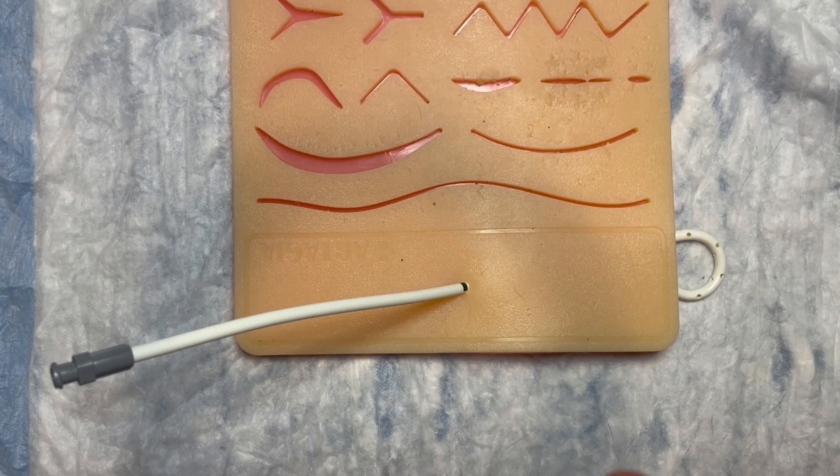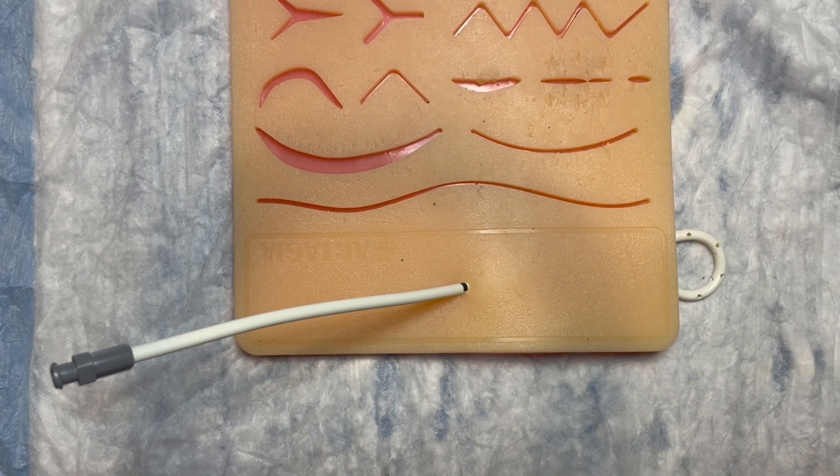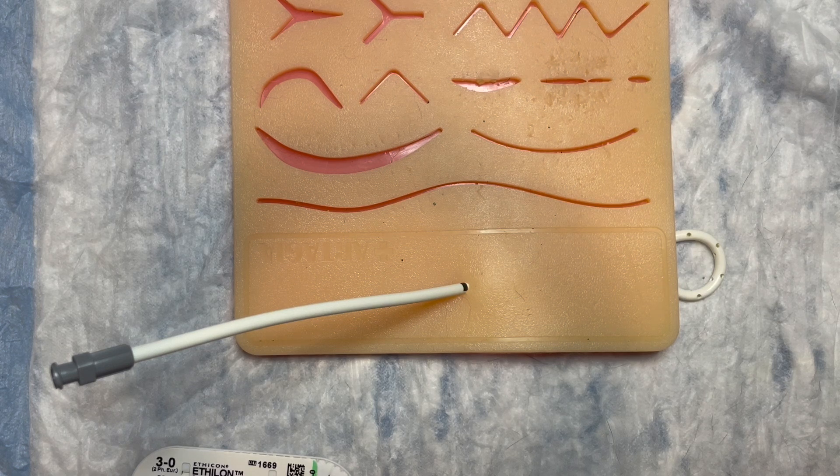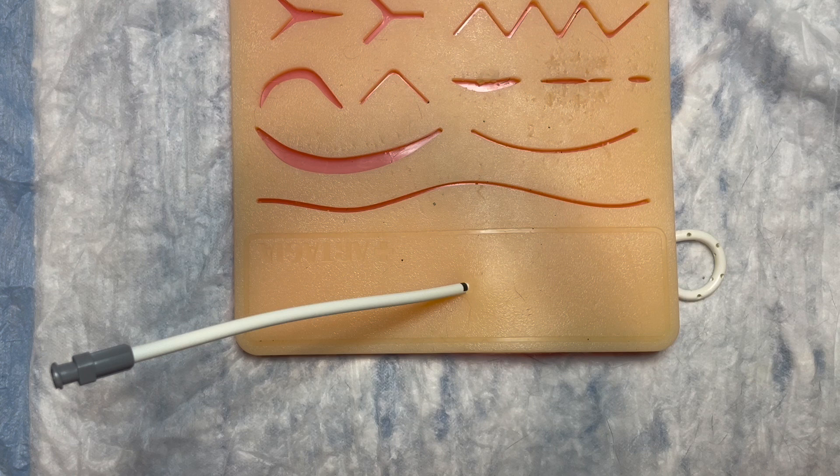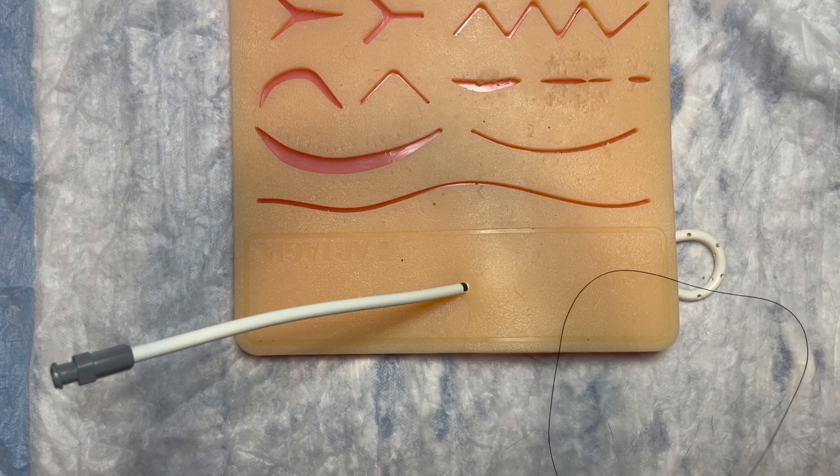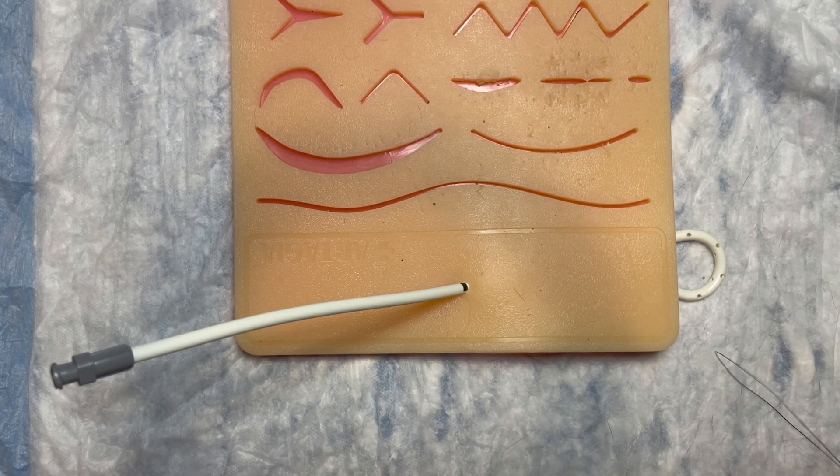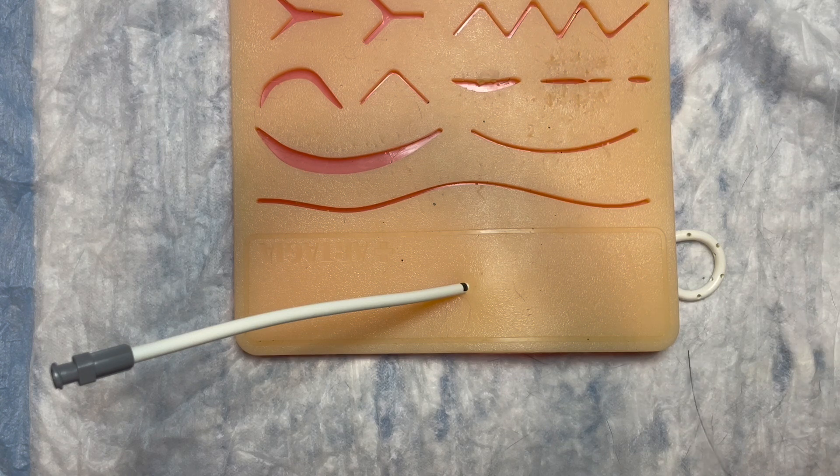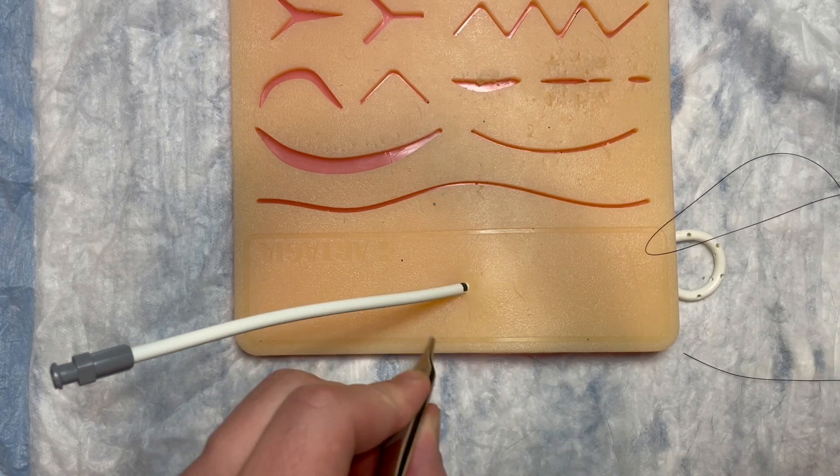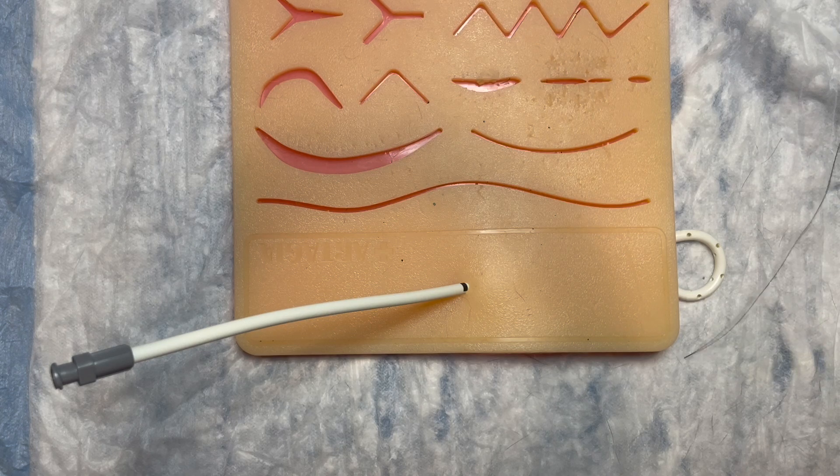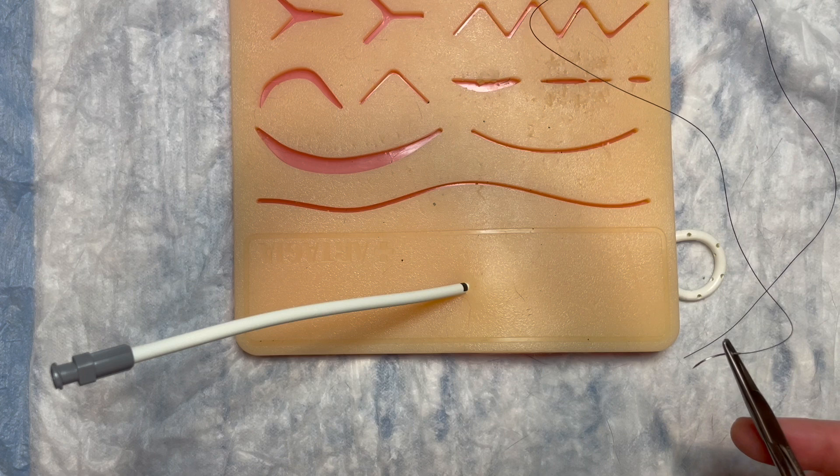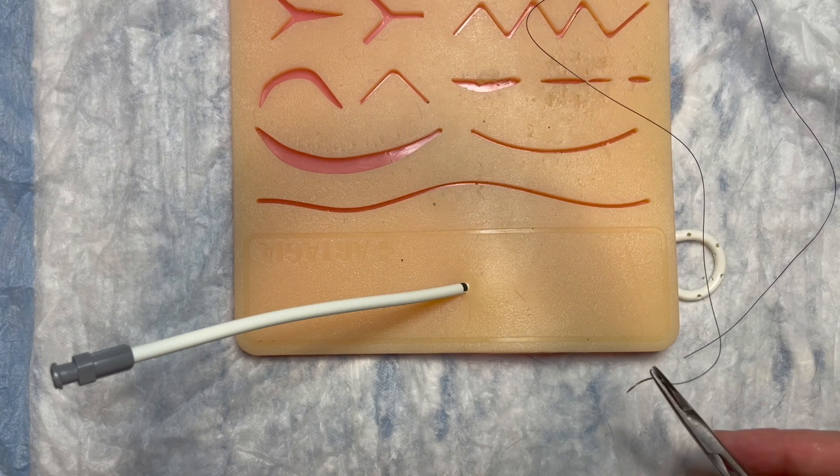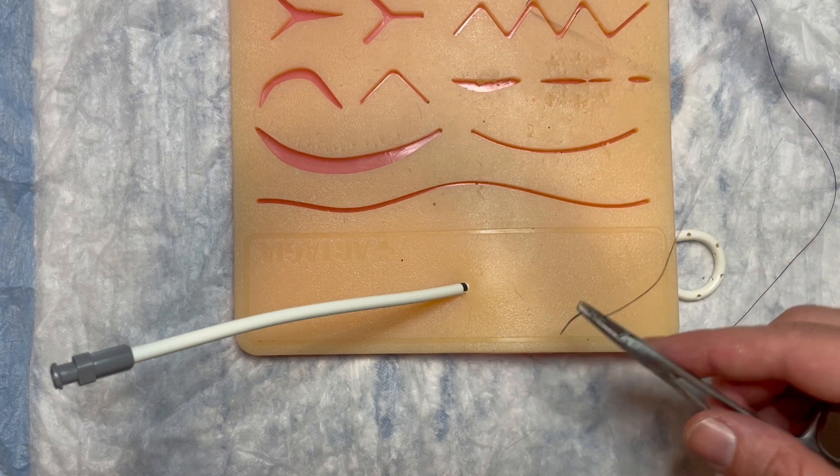Okay, so I've got my pigtail catheter in place, I've got some suture here, and we are going to secure this pigtail to the skin, make sure it does not come out. So the first thing I want to do, I want to make sure I anesthetize a really big wheel around the pigtail to begin with, so therefore when I put this stitch in it's not going to cause the patient any pain.